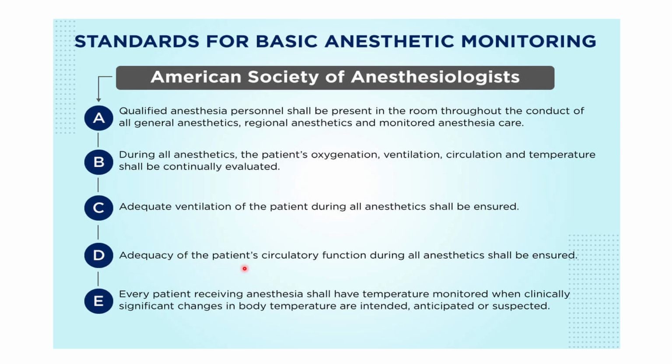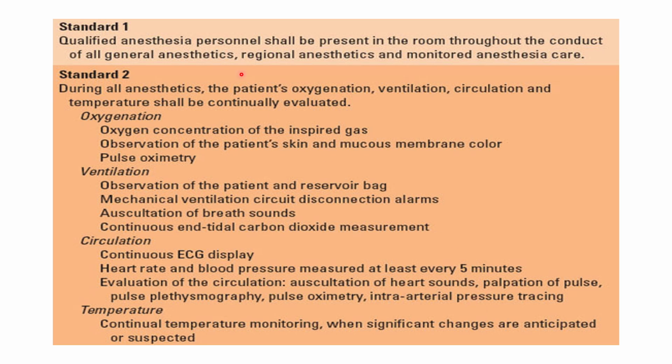Adequacy of the patient's circulatory function during all anesthetics should be ensured. And as we said, temperature monitoring is needed when there are clinically significant changes in body temperature, whether intended, like in neurosurgery operations; anticipated, like in long exploration operations; or suspected, if we are going to have a violent change in body temperature during operation, and large fluid shifts during the operation.